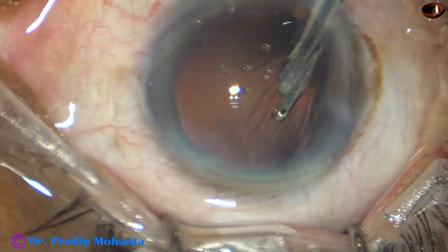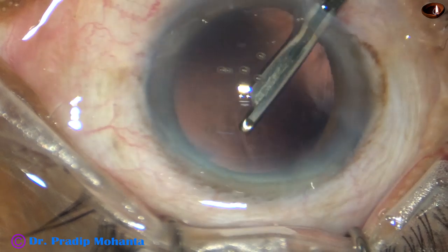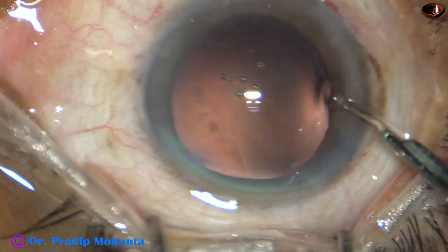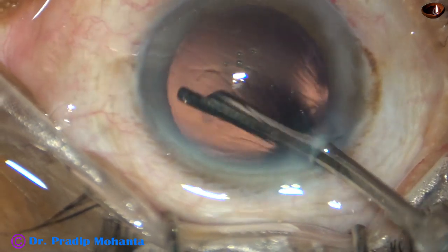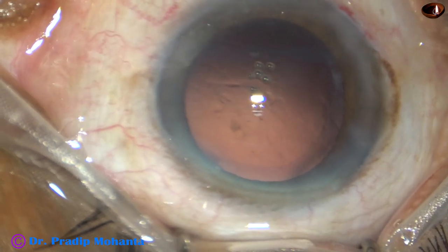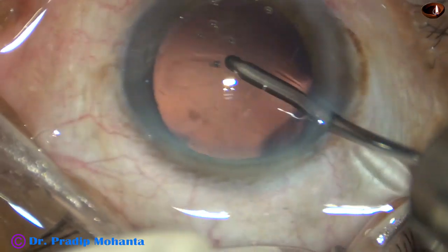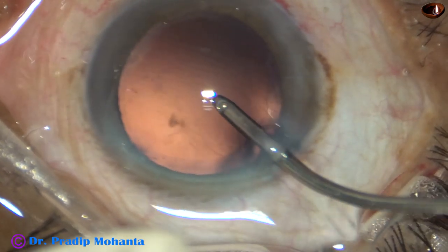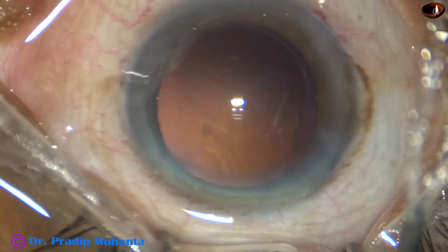The cortical cleanup is done. You can use bimanual irrigation-aspiration also, but this is a very safe instrument — a 23G Simcoe cannula. This is an irrigating probe being used to polish the posterior capsule.